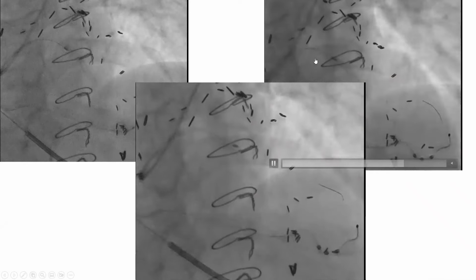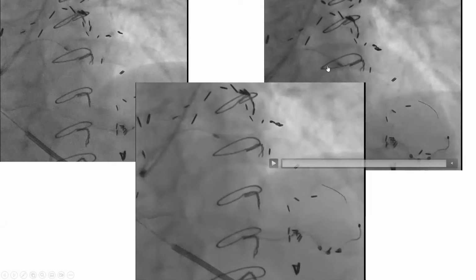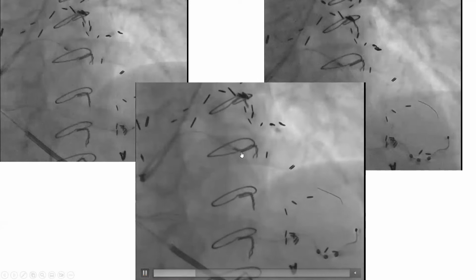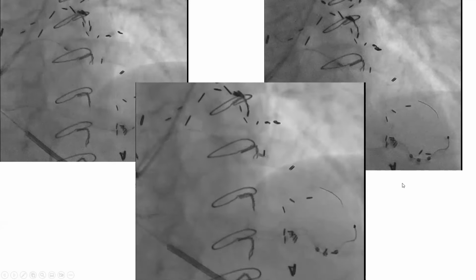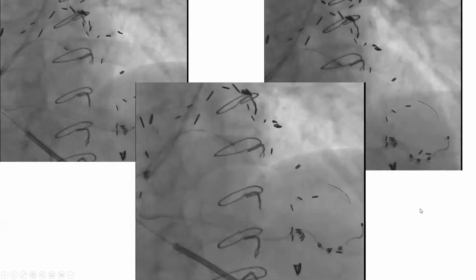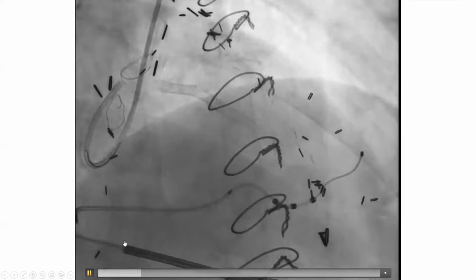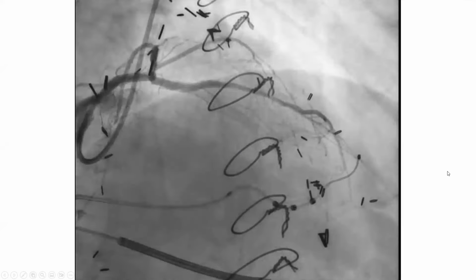And you can see here, around the 5th or 6th pass, we're starting to peck more at the lesion. Then here at the 6th pass, we crossed it. So brief, slow pecking, 5-6 passes before I fully penetrate the stent. Then we eventually stented from the LAD to the diagonal with very good result.